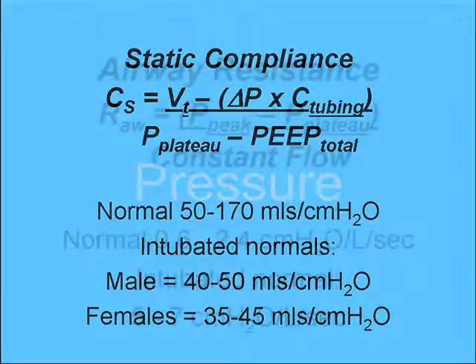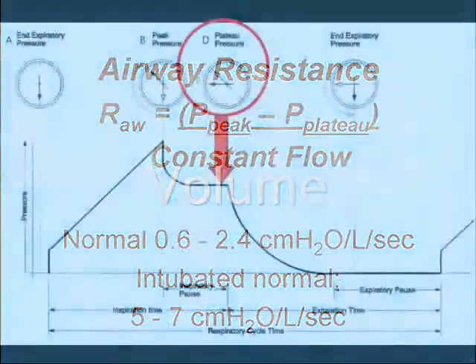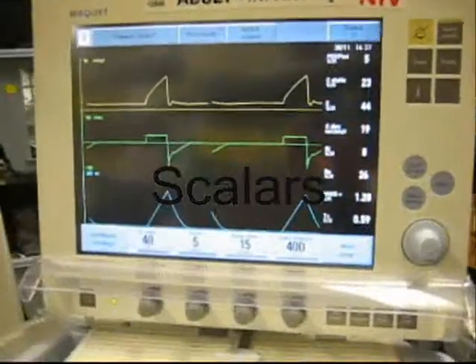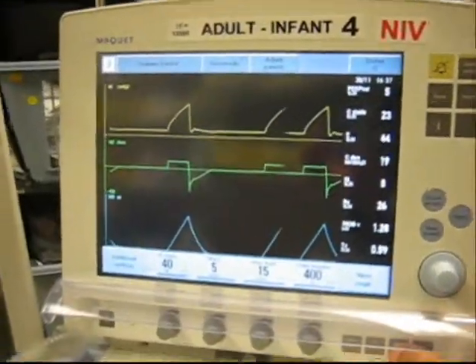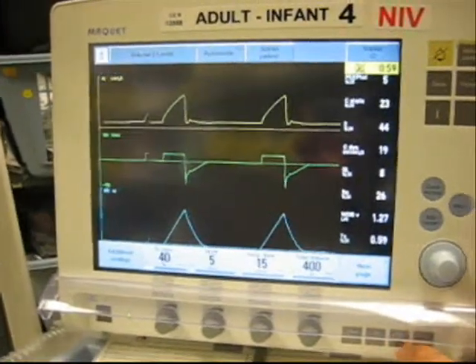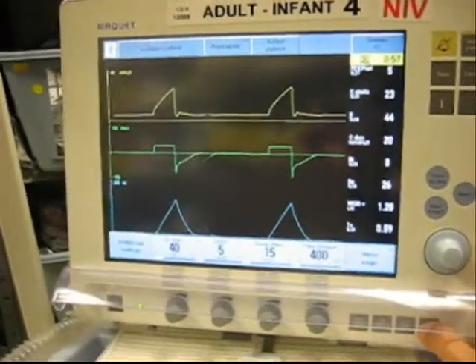It may seem that the theory and the skills associated with pulmonary mechanics are many and varied. By reviewing this competency-based objective video and bedside practice, you should become competent and able to perform this bedside practice.